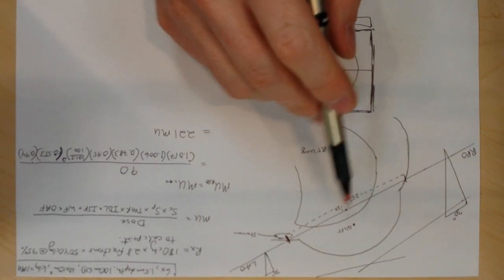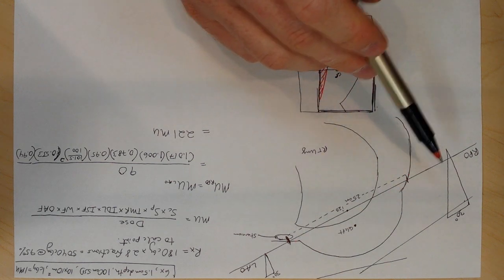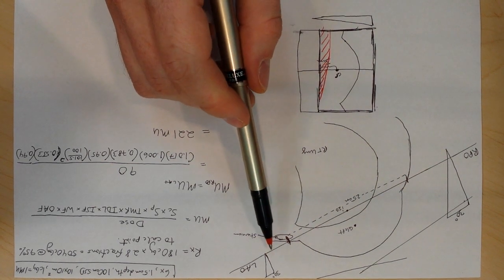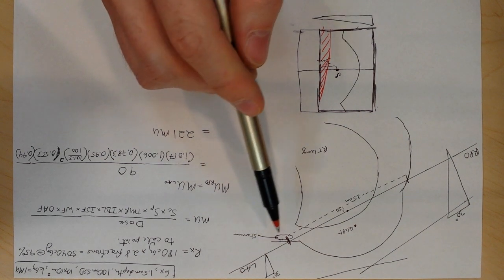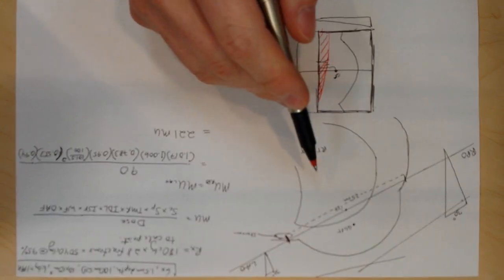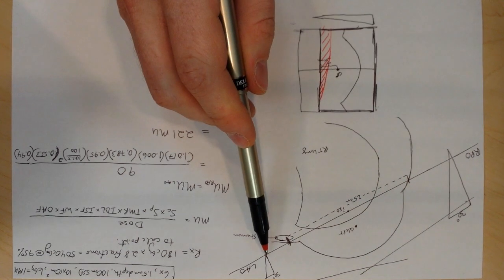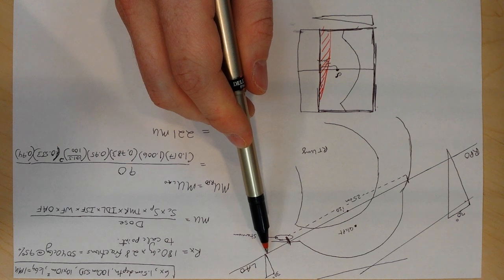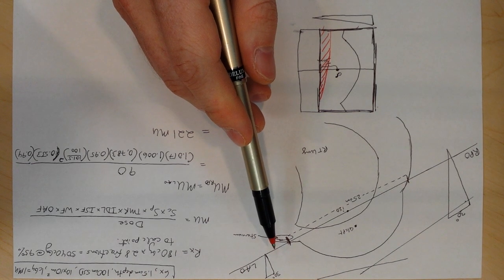most modern day radiation therapy departments are really going to limit doing wedges now. People have gotten away from doing wedges because we've learned that the medial wedge tends to scatter radiation to the contralateral breast and actually increases the risk of malignancy. And with the advent of segmented planning or forward planning using the MLCs to segment out the hot spot, wedges have kind of gone away, and now with dynamic wedges as well.